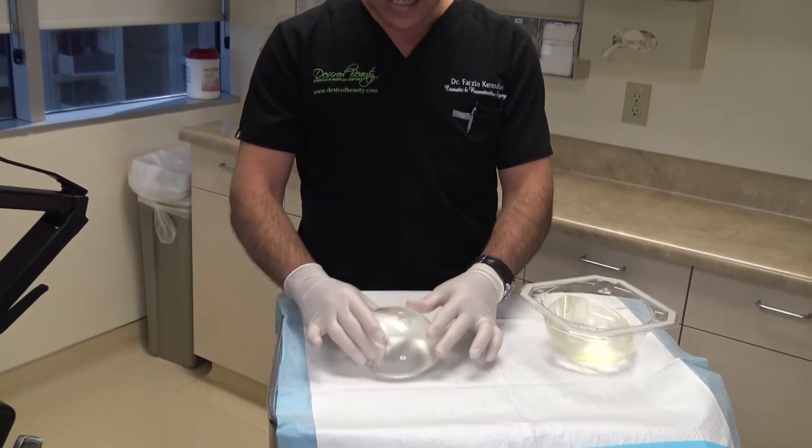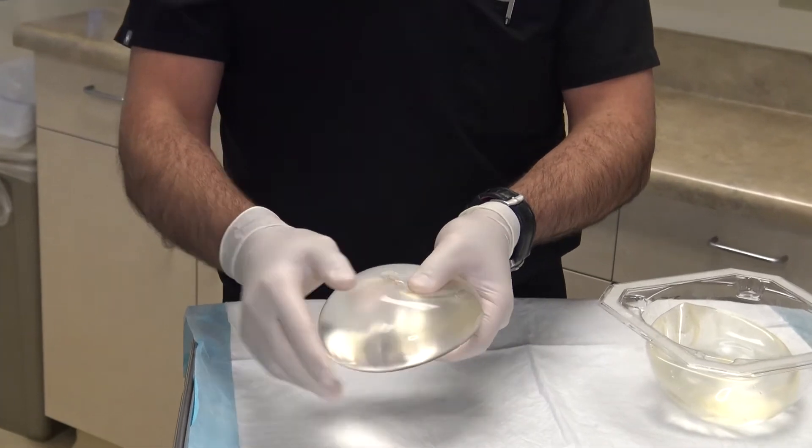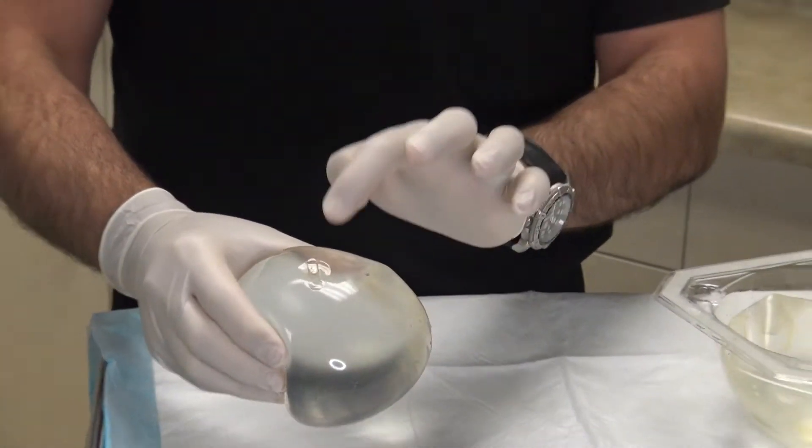This is the implant that was not deflated, and you can see there's no leakage. There's a valve on saline implants, and that's where leakage usually happens — when this valve becomes insufficient.